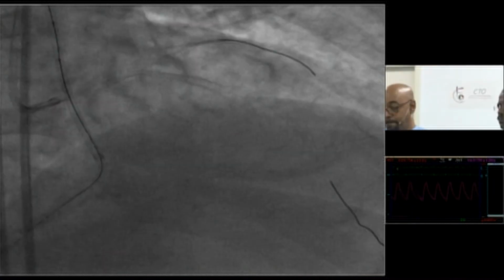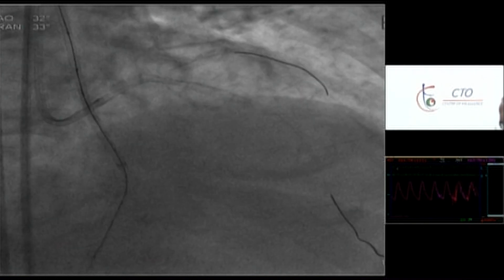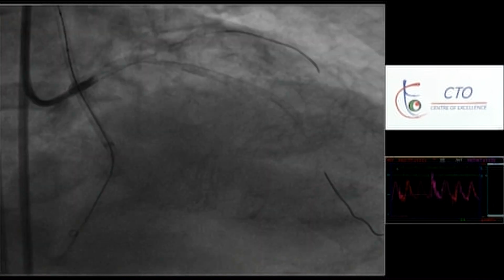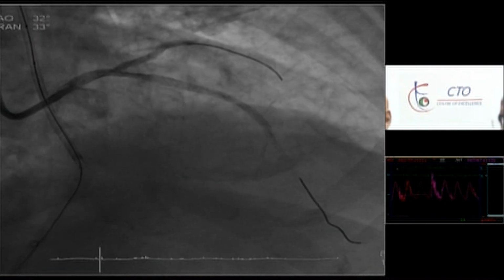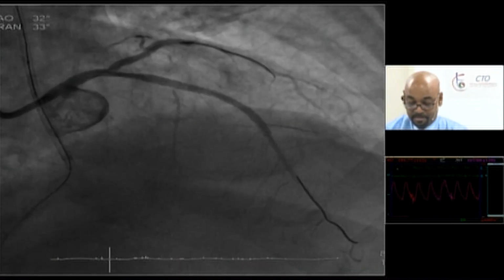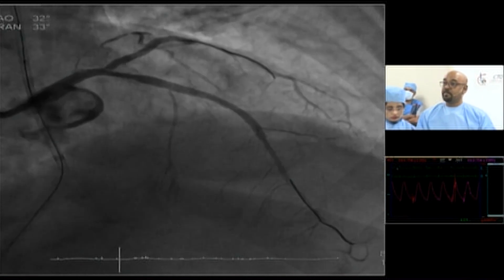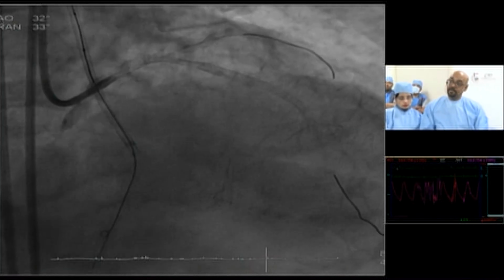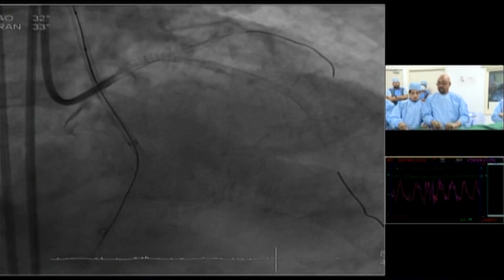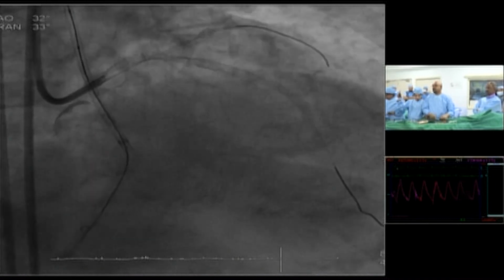Yeah. So we will give you a picture before we go post dilatation. Okay. So that's the LAD for you. Yeah, I just needed to tune up with the non-compliant. So we're going to use a non-compliant 3.5 by 8 in LAD and go up probably to 20 atmospheres. Then before that, I would rewire the circ because now the wire is actually outside the stent.